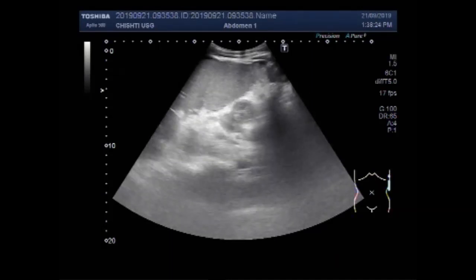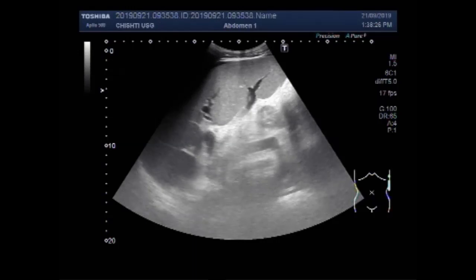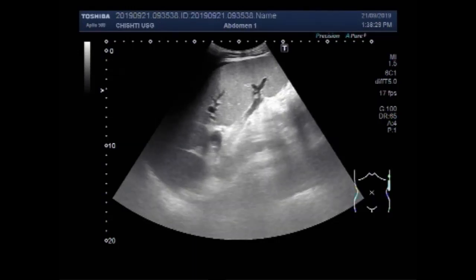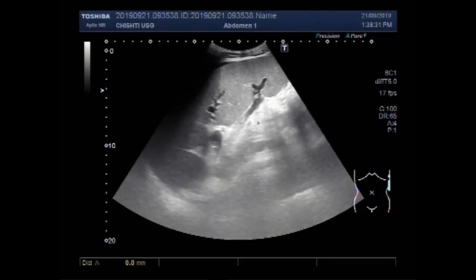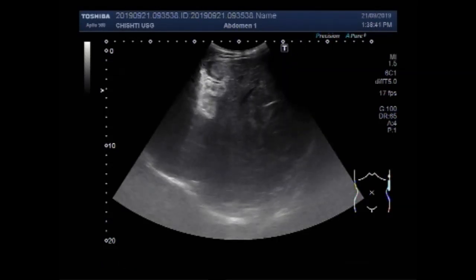Now you are going to see the spleen. The spleen is also enlarged, and you can see it measures about 20 centimeters. It is quite large.